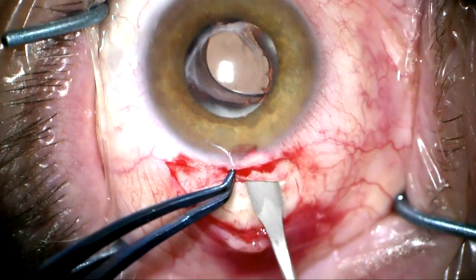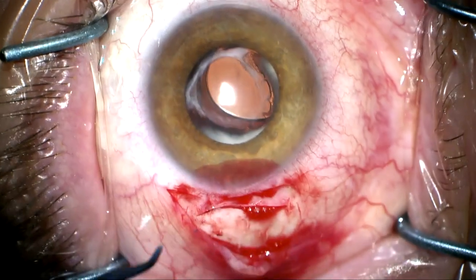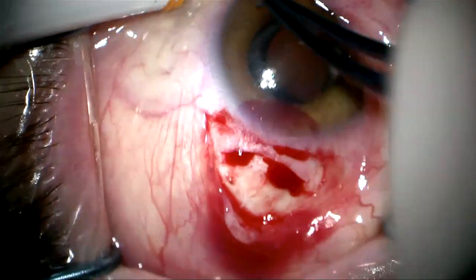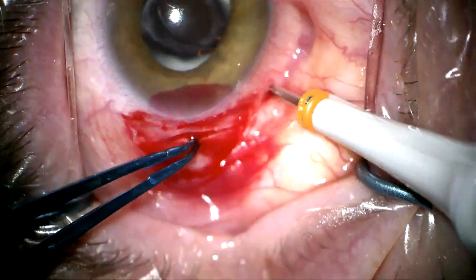What we're going to do is create a scleral tunnel incision. It's very important that this is self-sealing. We're now going to place our pars plana trocars because we're going to need to do a vitrectomy.